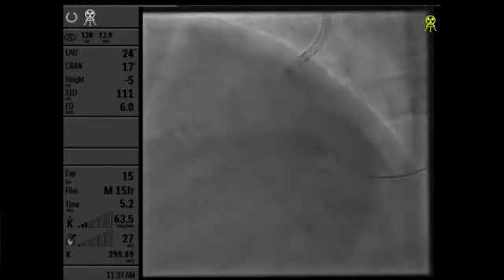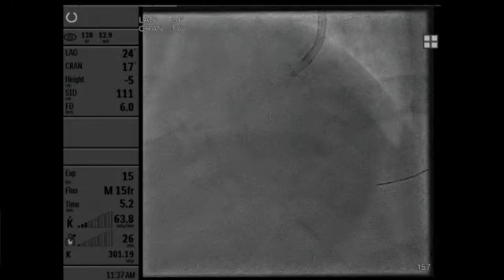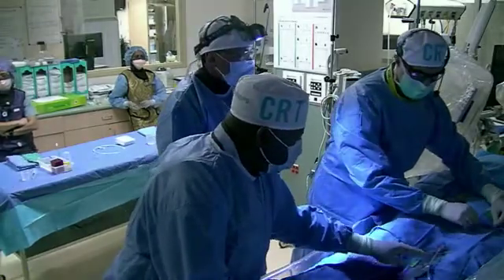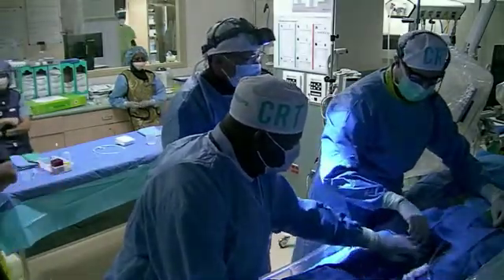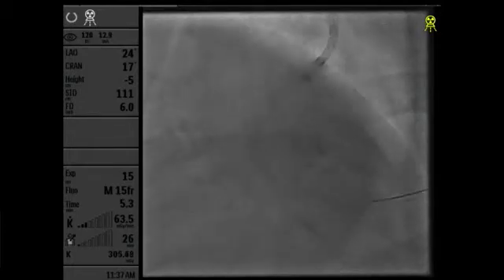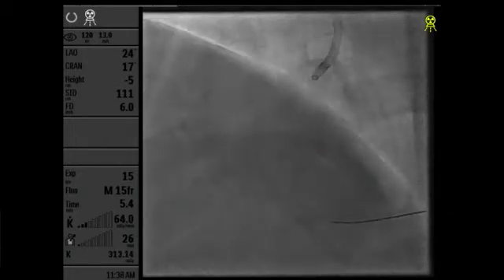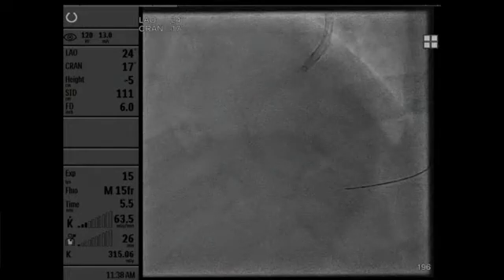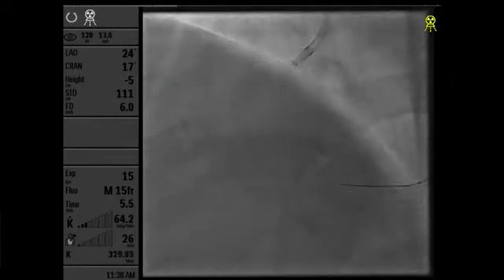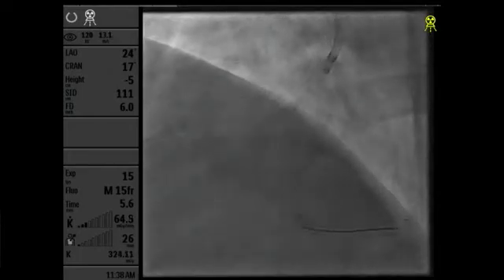Actually, Dr. Koryakis, consider that this lesion is more eccentric, like nodules, right, Hader? Rather than concentric, what do you think happens when we deliver the energy of Shockwave on these nodules? The reason I asked is that we've been playing with this in the SFA and the common femoral. We've noticed that if I do it on a concentric lesion, my God, it works like magic. But when you have nodularity, especially if it's thick and big, I don't get a perfect result. So maybe a best choice would be to use orbital atherectomy to get to those calcifications. Just a question.